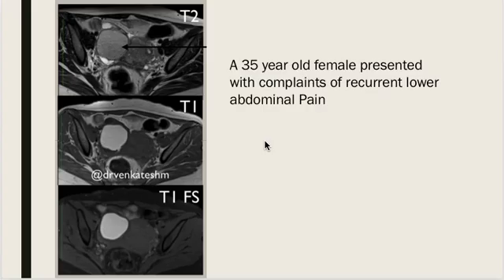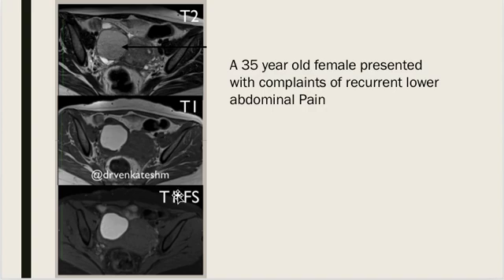A 35-year-old female presented with complaints of recurrent lower abdominal pain. We are looking at three axial MR images: a T2 weighted image, a T1 weighted image, and a T1 weighted fat saturation image.